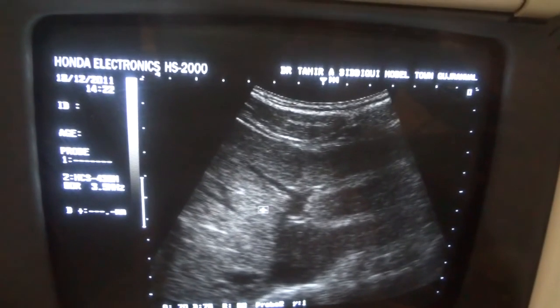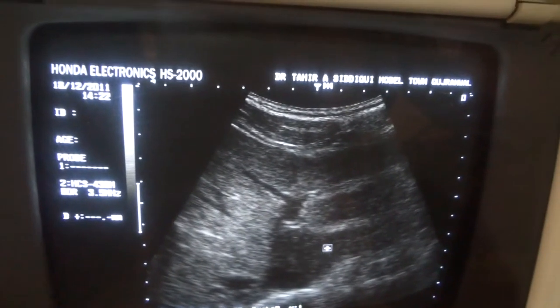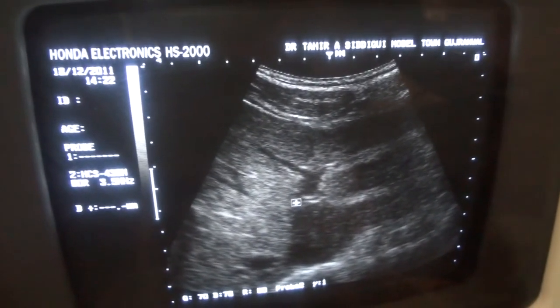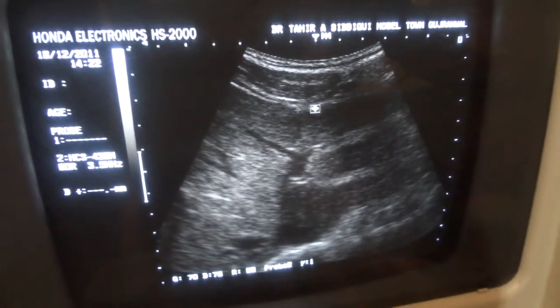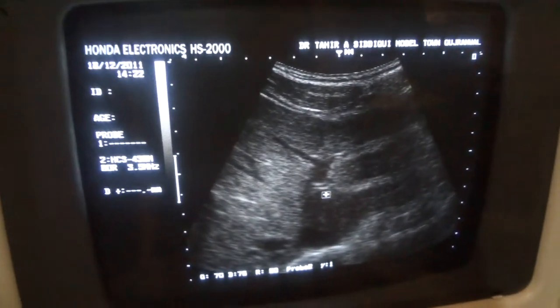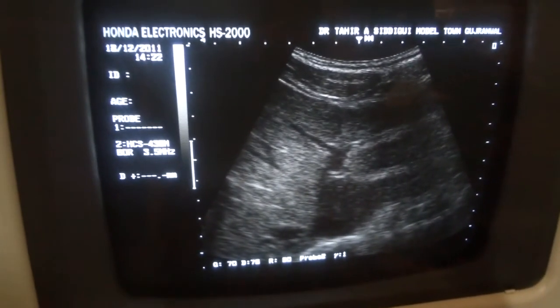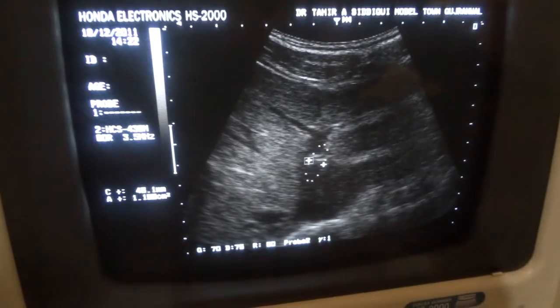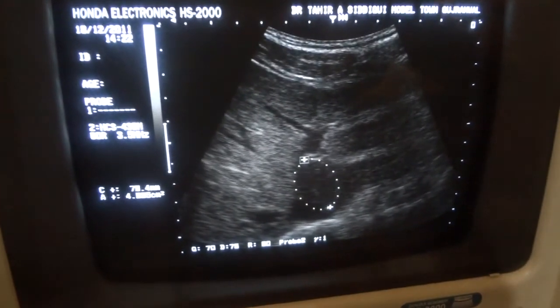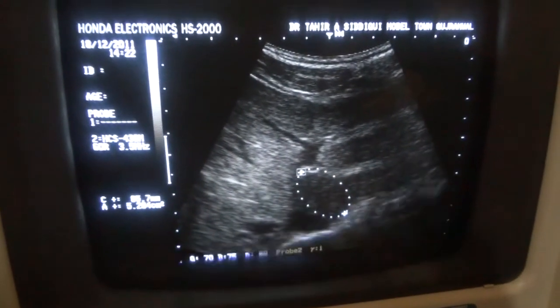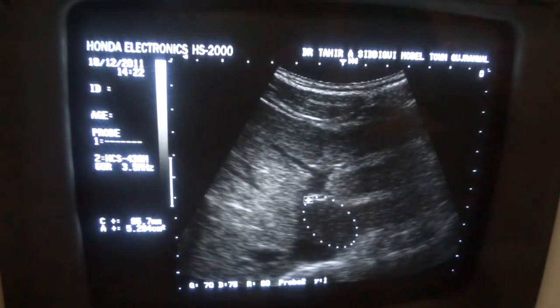If we concentrate a little bit, because this is the transverse view of the liver, this portion is angled upward.